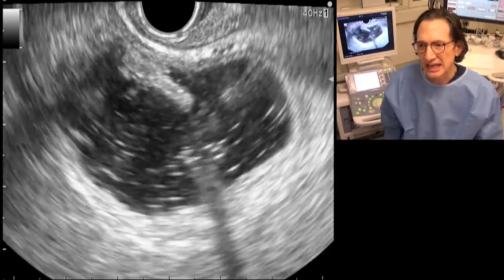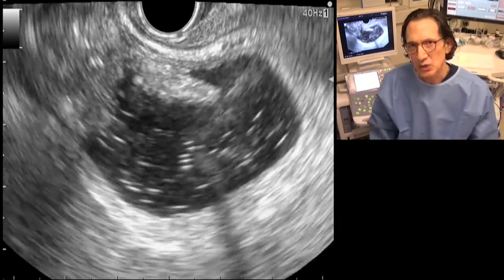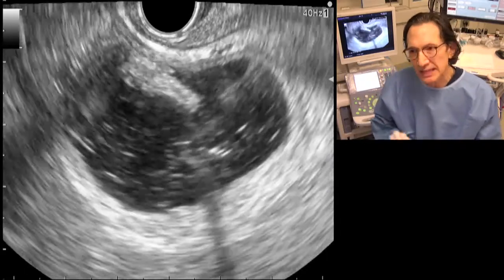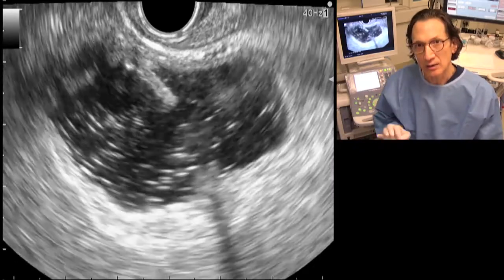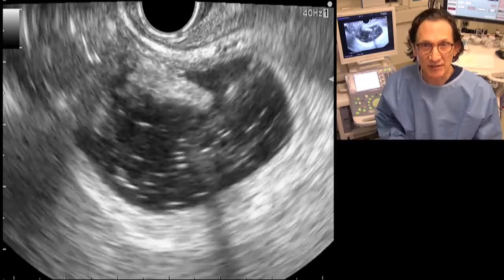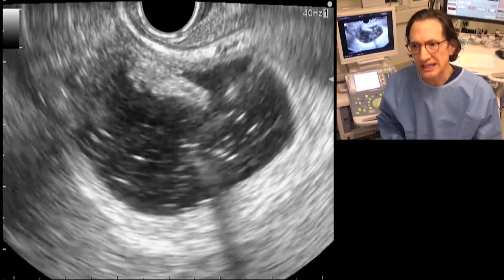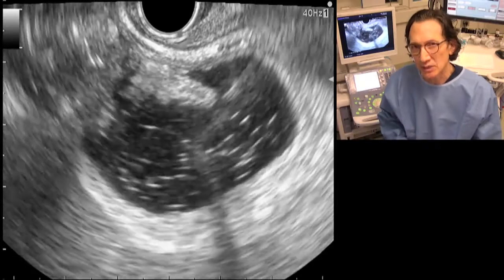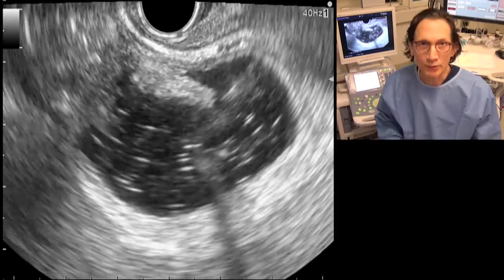But this at least gives us the ability now to access the gallbladder and immediately deliver the lumen-opposing stent while avoiding any risk of bile leakage. That's the goal, to avoid or eliminate the risk of bile leakage. And the only way you can really eliminate that risk is if you eliminate any over-the-wire exchanges.